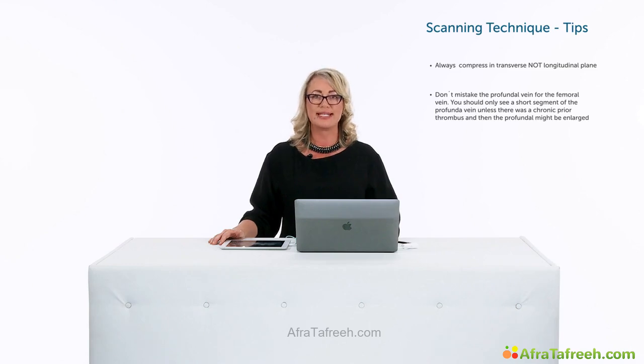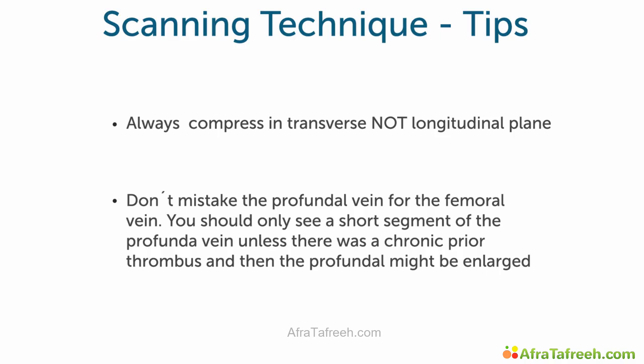Some takeaway scanning tips to remember. Always compress in transverse, not in a longitudinal plane. Don't mistake the profunda vein for the femoral vein. You should only see a short segment of this profunda vein unless there's been a prior chronic thrombus, and then the profunda vein may be slightly enlarged.